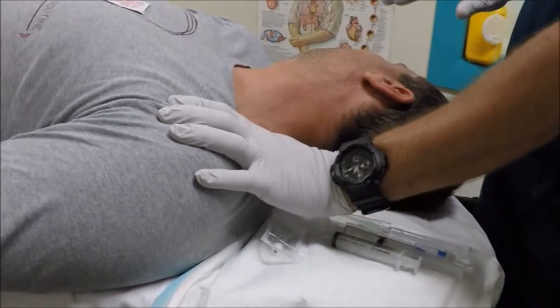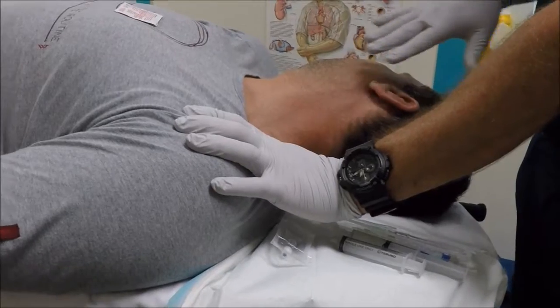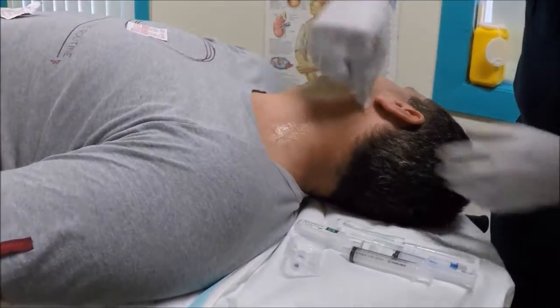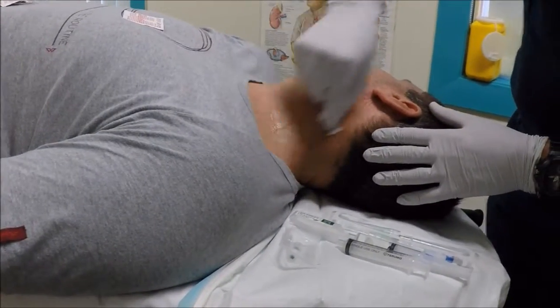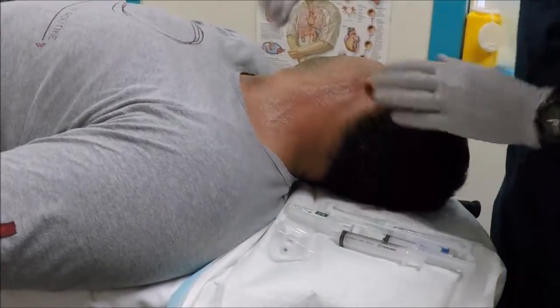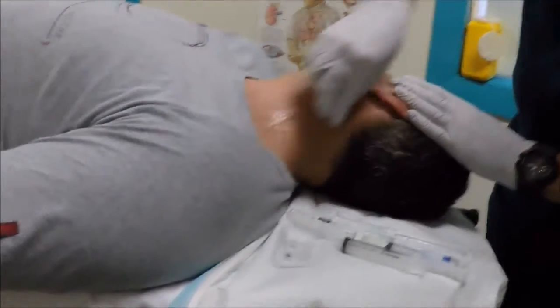As with any IV access or any peripheral venous access, we want to maintain sterility. We're compromising the patient's integumentary system, which is the majority of their external immune system. So we want to make sure that we're well and truly sterile using aseptic technique. In this case, we'll choose to swab twice.